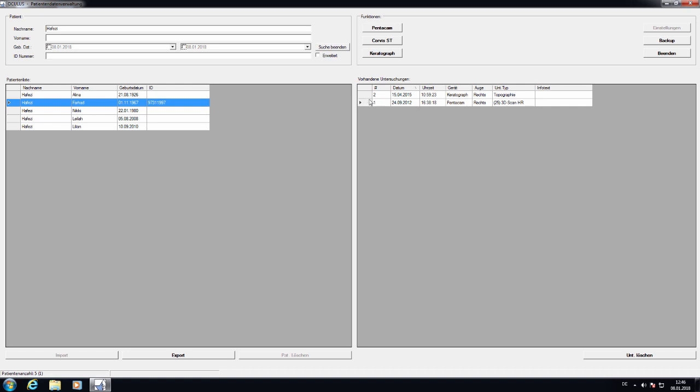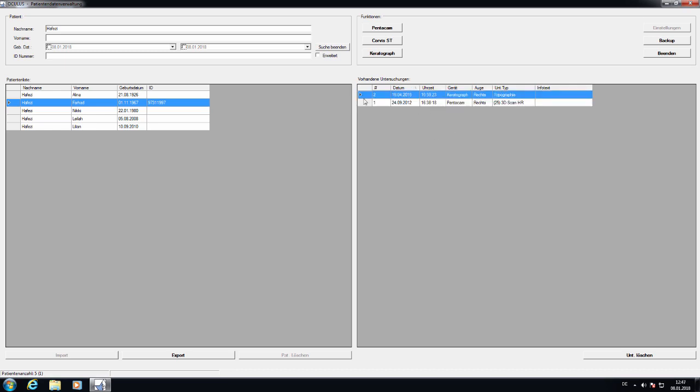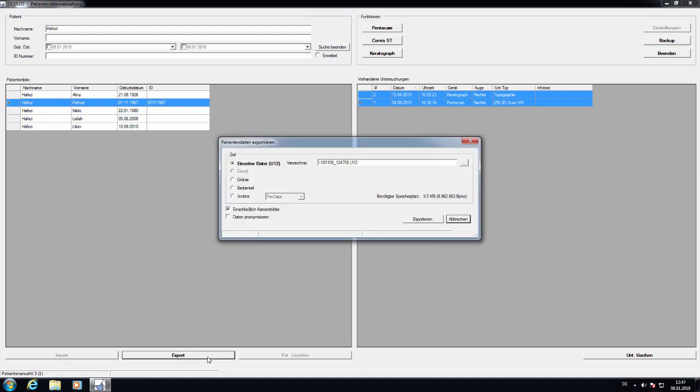Let's say I'm interested in the Pentacam measurement, then I can choose this one or I can press Shift and choose more than one. Two, three, five, all of them. And then I press on Export.